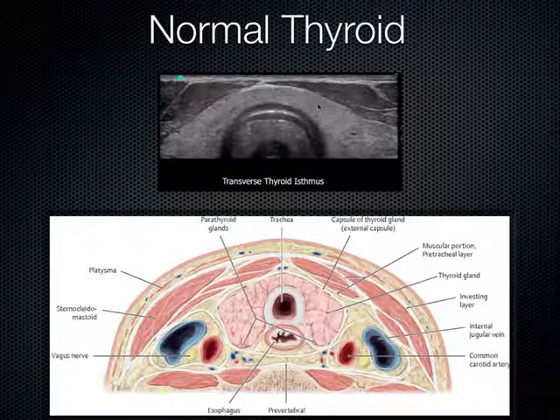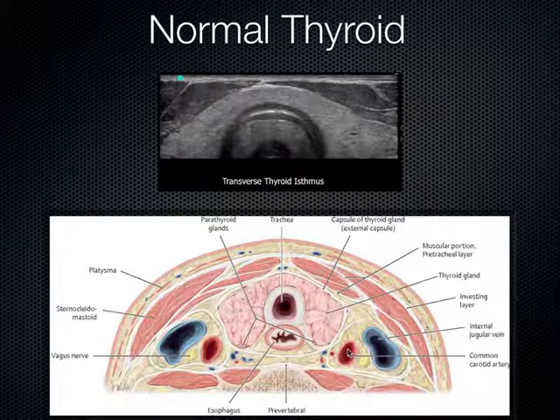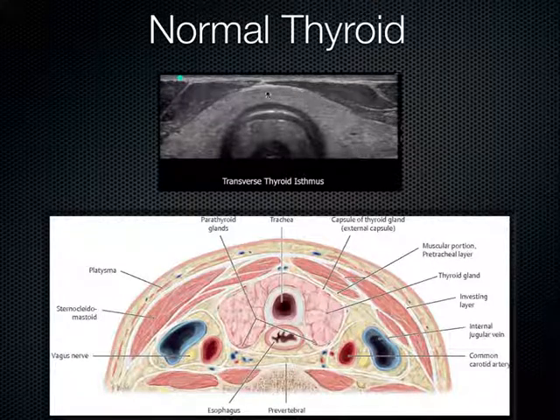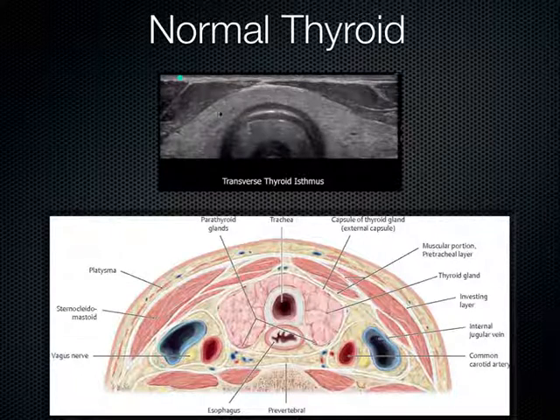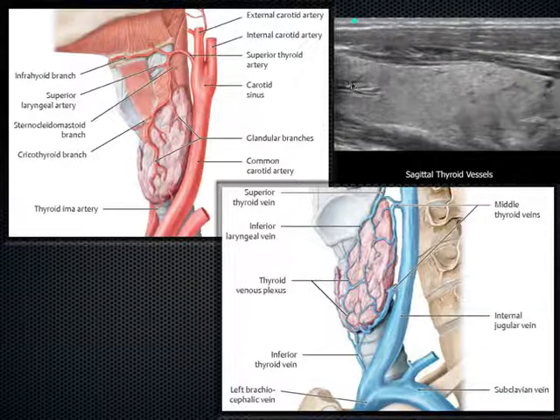For the thyroid, place the probe in a transverse plane. The thyroid has a right lobe, isthmus, and left lobe, located medial to the carotid arteries and just posterior to the neck muscles. It should have a very nice isoechoic, somewhat hyperechoic texture — similar in glandular appearance to testicle tissue. In the sagittal view, you can see vasculature passing through it.